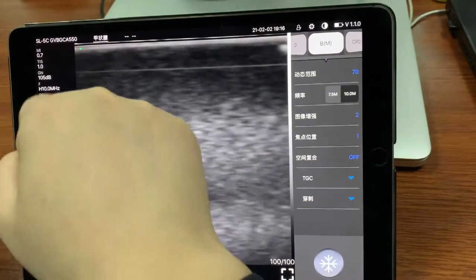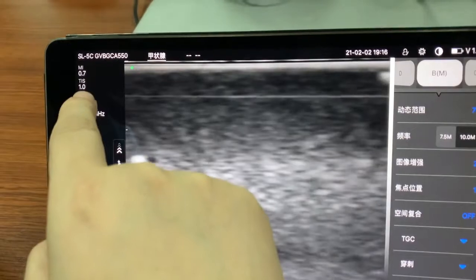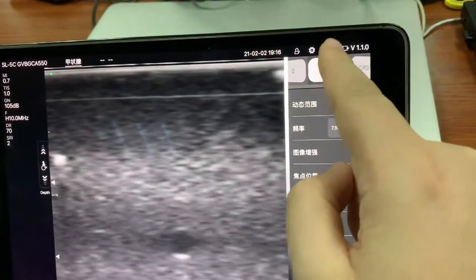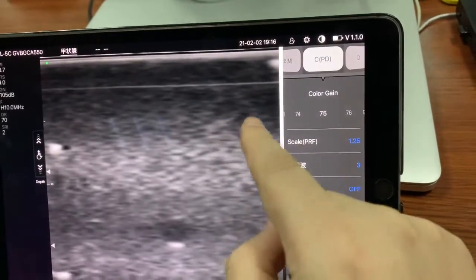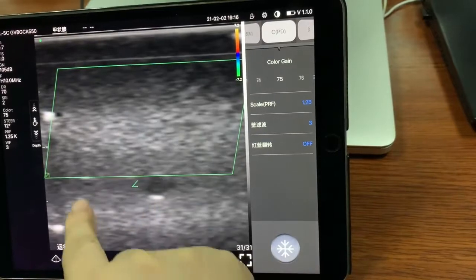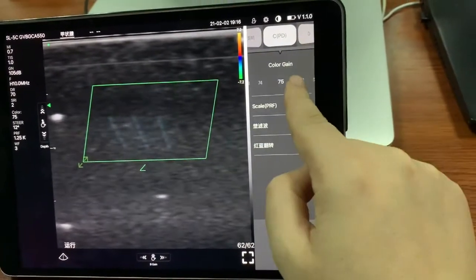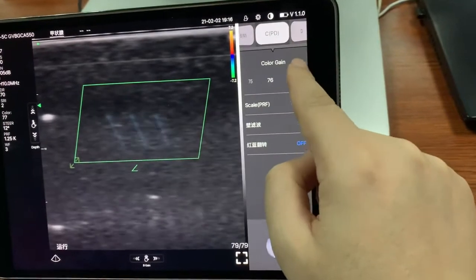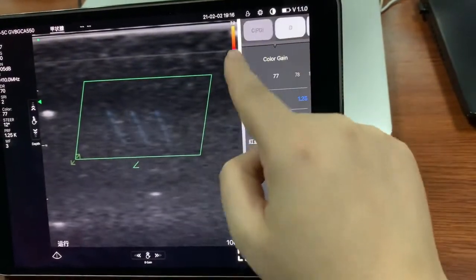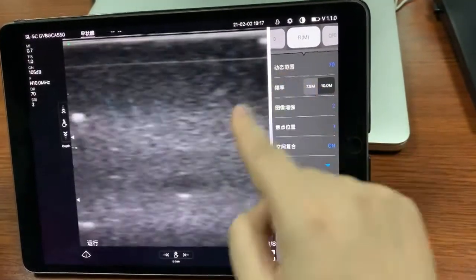Here you can see the parameters. We can adjust settings in different modes — adjusting the size and gain in color mode, and also in the gain mode and the B mode.